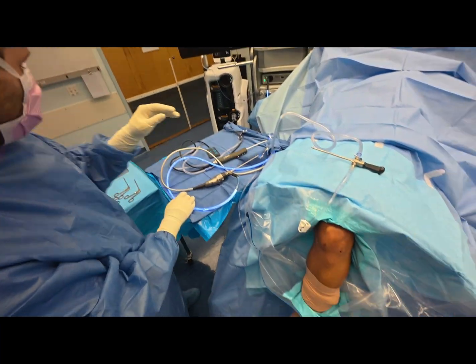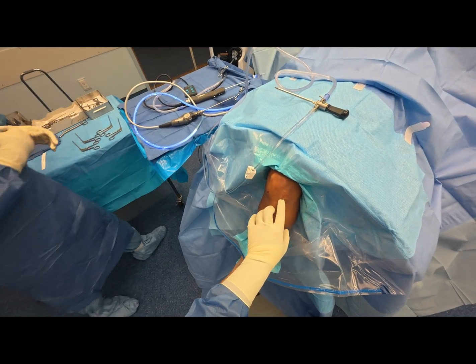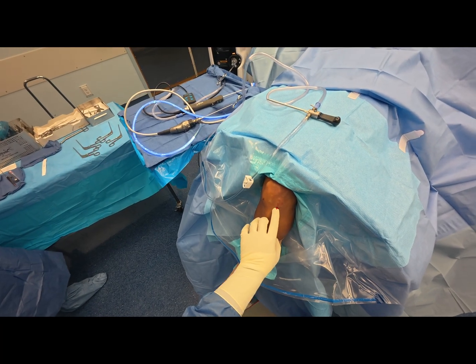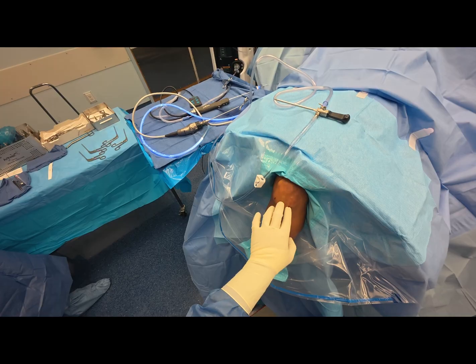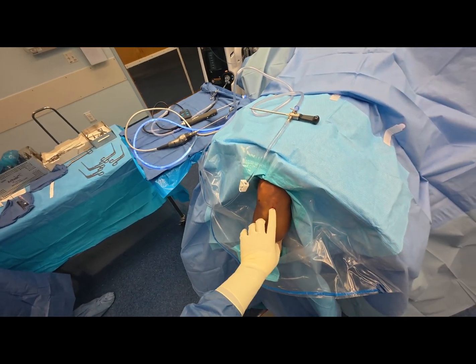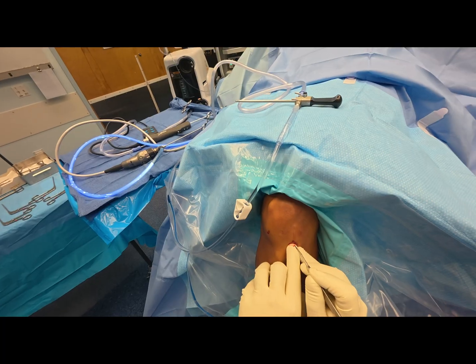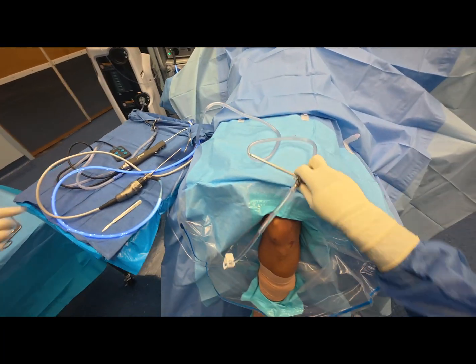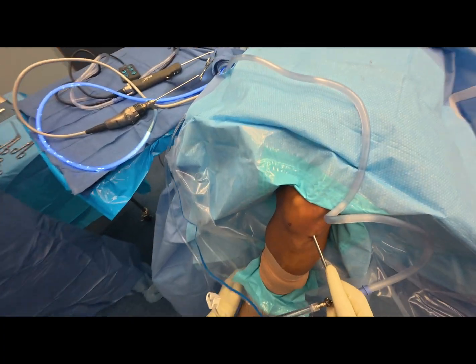Sometimes it's hard to assess on an MRI after arthroscopy whether or not there's a tear, because it's hard to contrast the findings with post-surgical changes. So here we're going to make an incision starting again at the level of the joint line. Go into the knee.